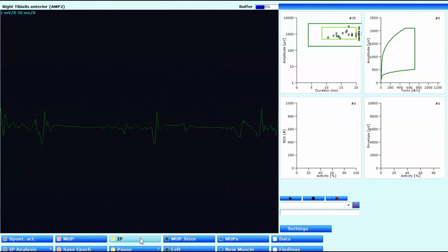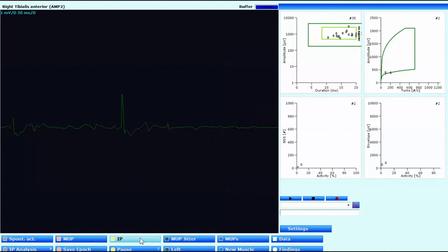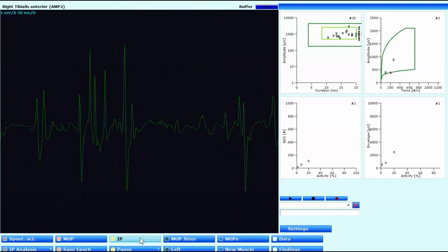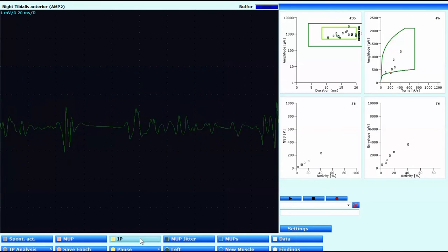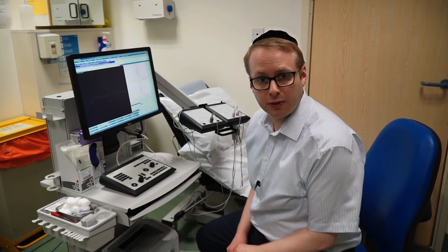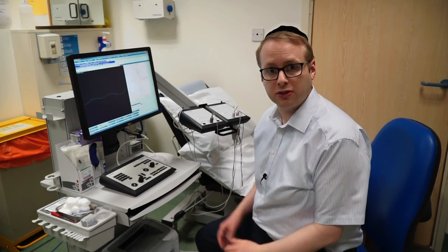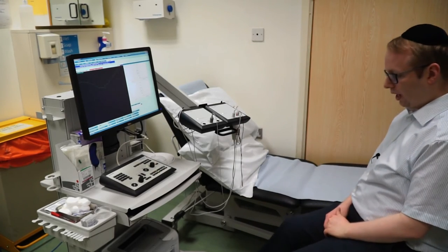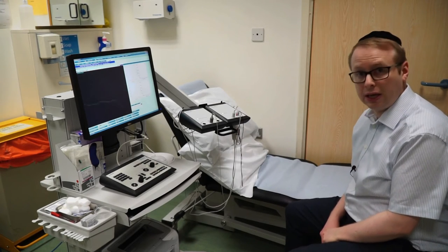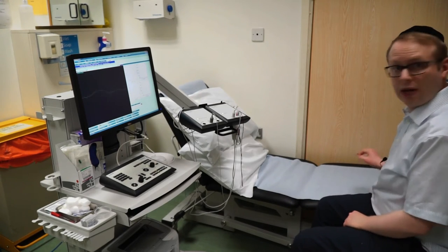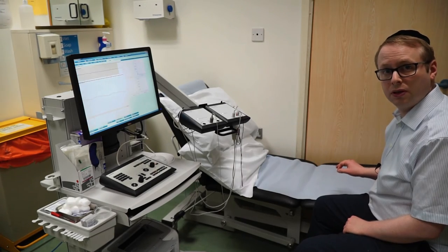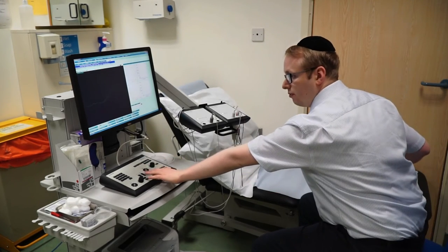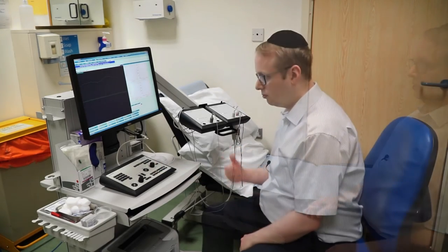Once we've collected enough data, we can then activate the Interference Pattern program by clicking on it, and then clicking on the IP analysis box to capture data. We can either do this via the control box or with the left paddle. What's very handy about this is that if I'm studying the patient's leg, all I need to do is move backwards and bring back the foot paddle, so I can control the program down where the feet are without having to stretch up and find the MUP analysis button — and so you can really work very quickly.